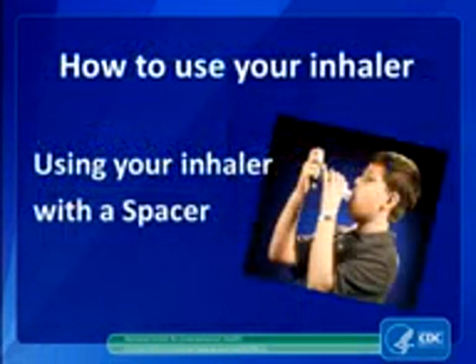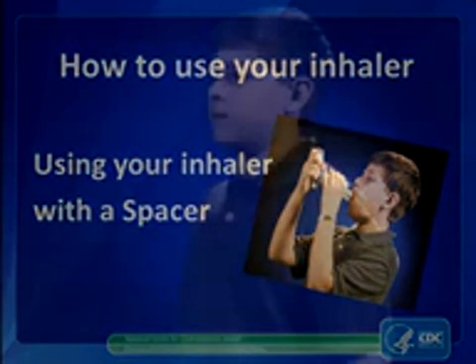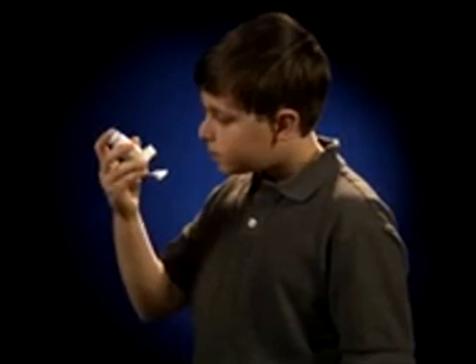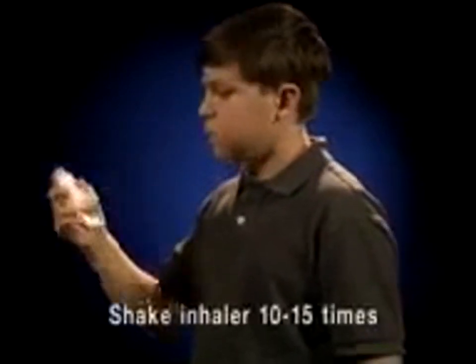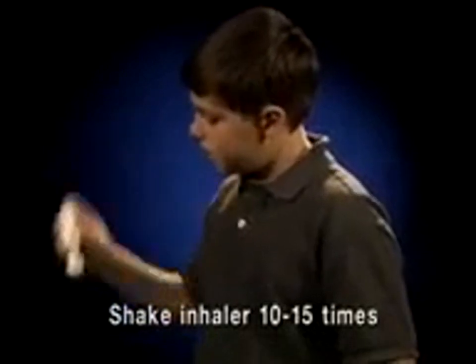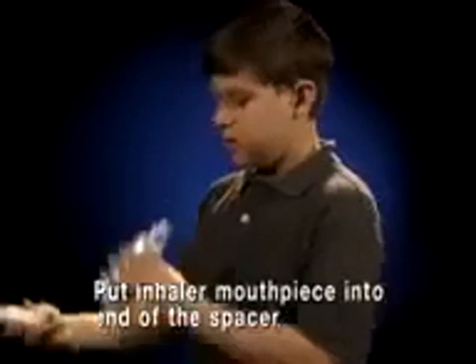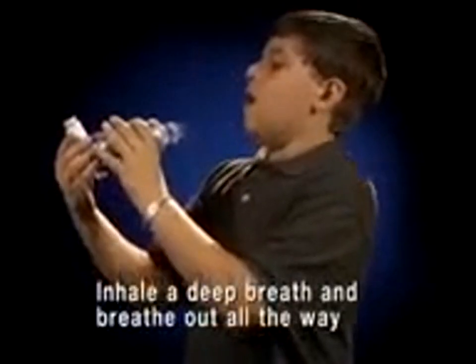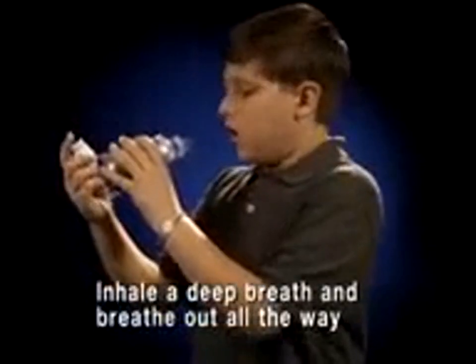Using a metered dose inhaler with a spacer. Take off the inhaler cap and make sure the mouthpiece and spray hole are clean. Shake the inhaler 10 to 15 times. Put the inhaler mouthpiece into the end of the spacer. Inhale a deep breath and breathe out all the way.